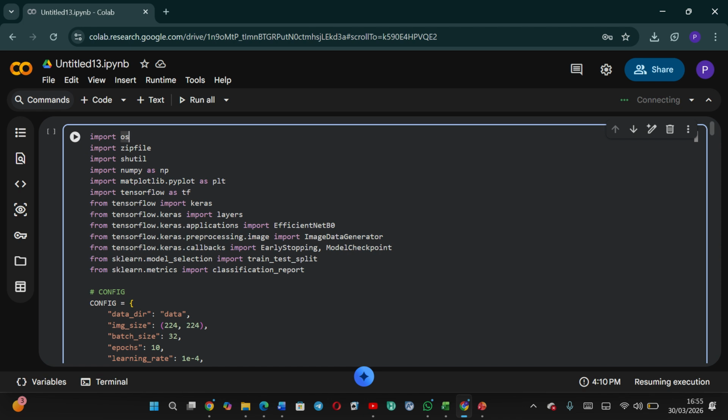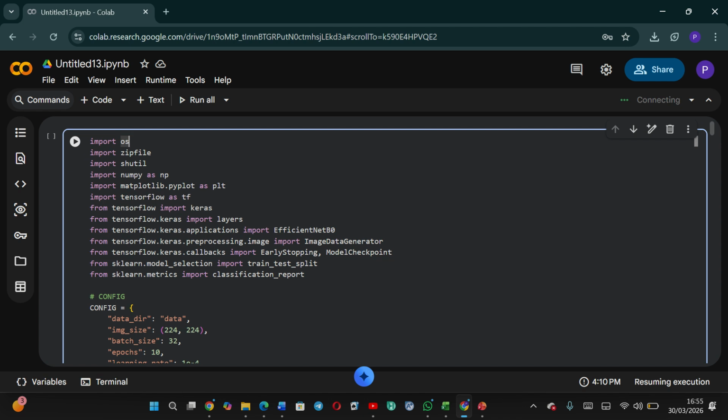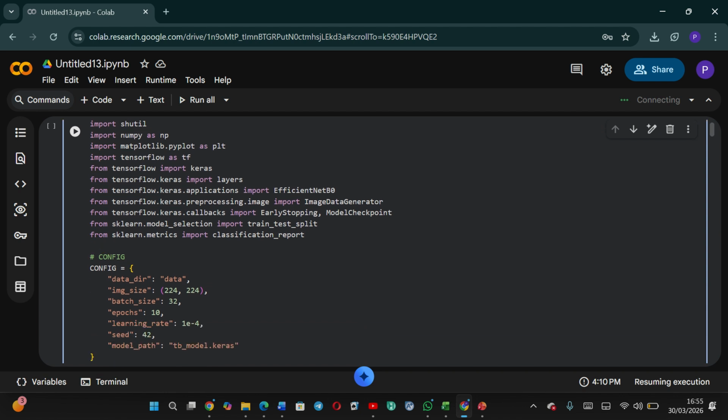In the first part of our code, we imported all the necessary libraries we will need. We imported TensorFlow and Keras for building the deep learning model, NumPy for numerical operations, Matplotlib for visualization, scikit-learn for evaluation, and os, zipfile, and shutil for handling the files. You didn't see us installing any of these because Colab already has them installed. All we needed was to import them.